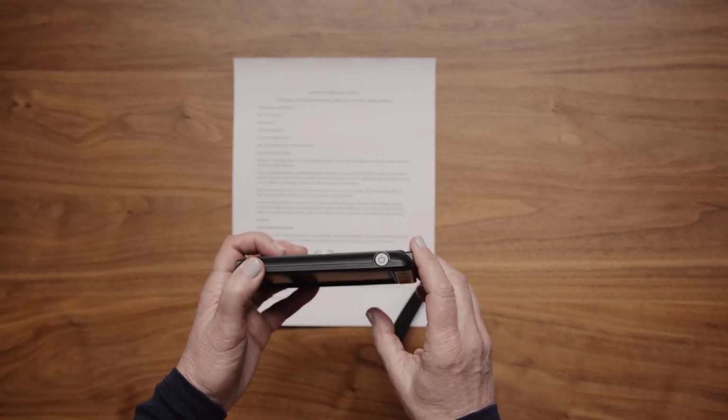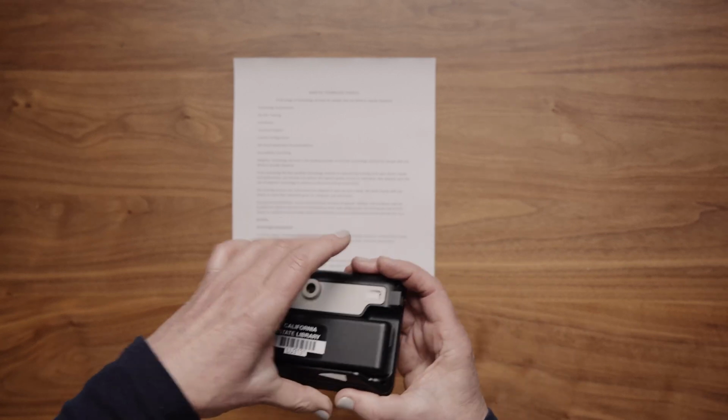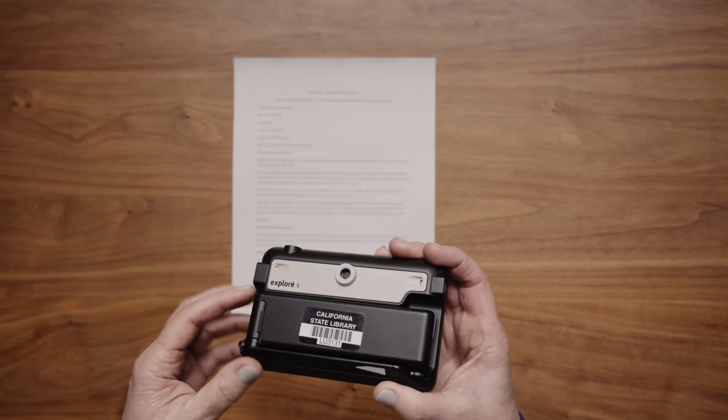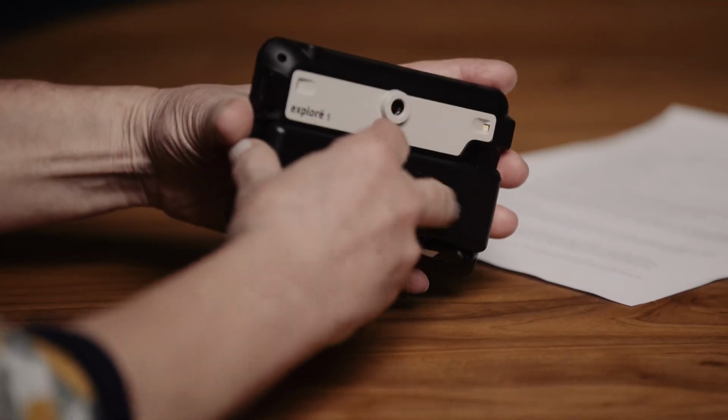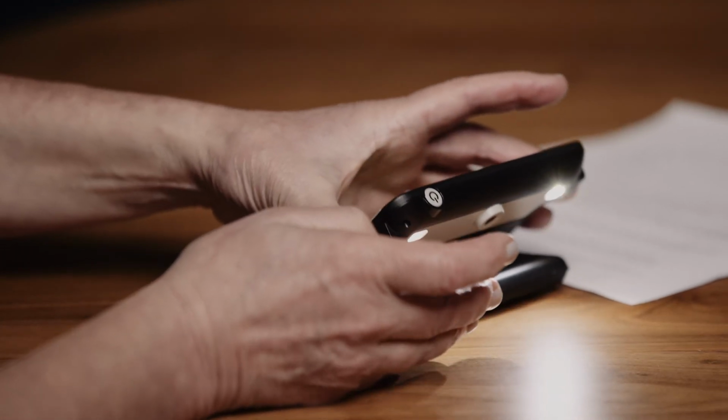Turn on or off the Explorer 5 by pressing and holding the power button on the top right edge of the device. Use the handle to turn on or off the device. Flip it to the right or open it vertically to use it as a stand.